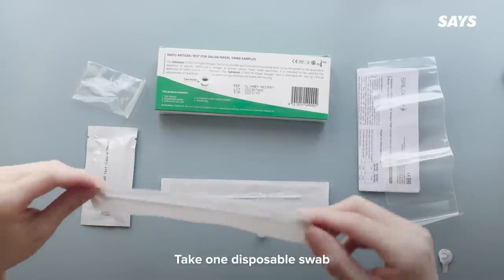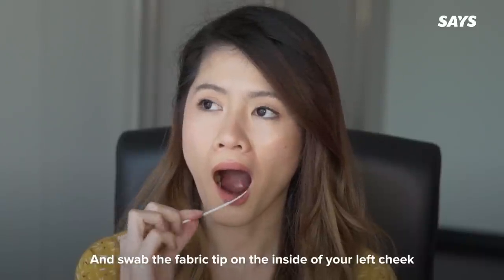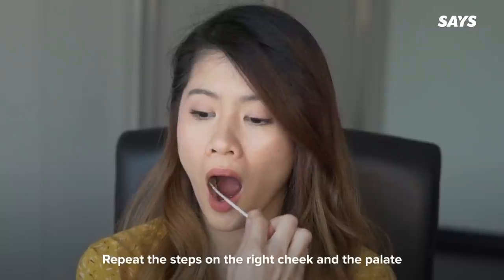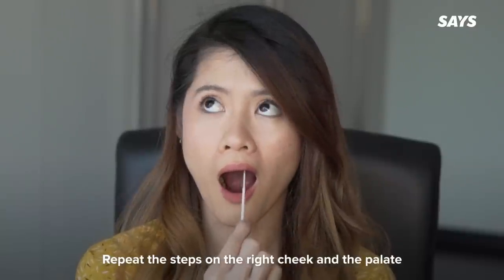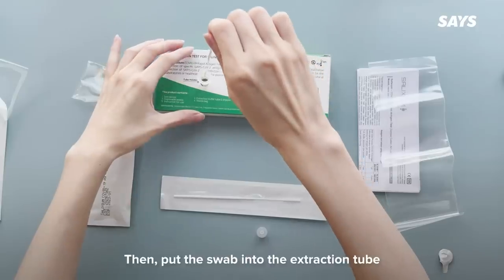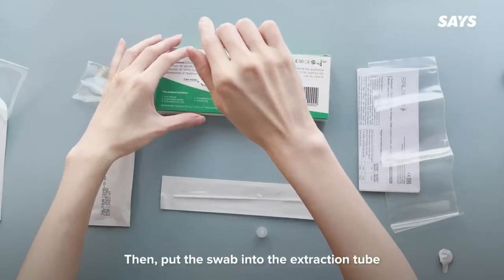Take one disposable swab and swab the fabric tip on the inside of your left cheek, up and down for at least five times. Repeat the steps on the right cheek and the palate. Avoid touching the tongue, teeth and gums. Then put the swab into the extraction tube.